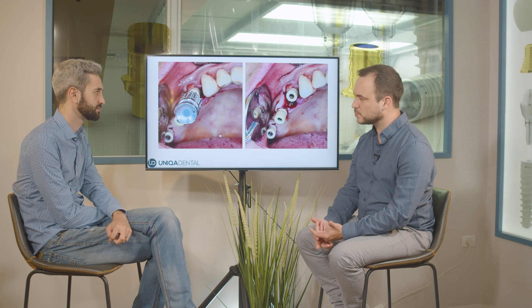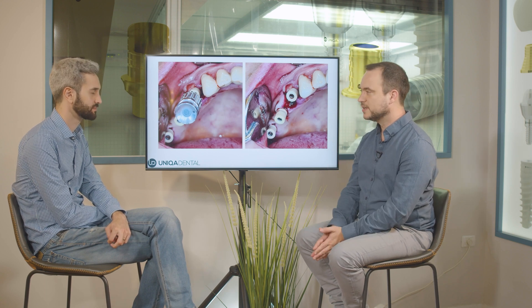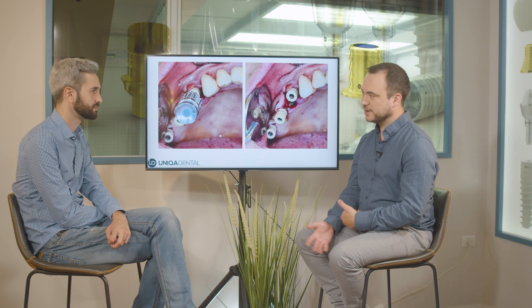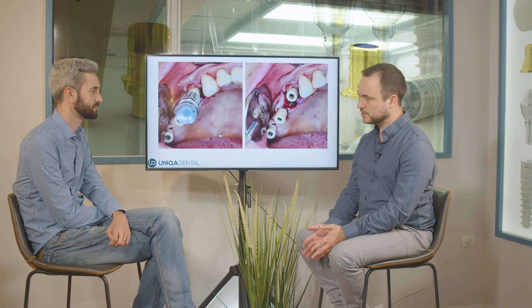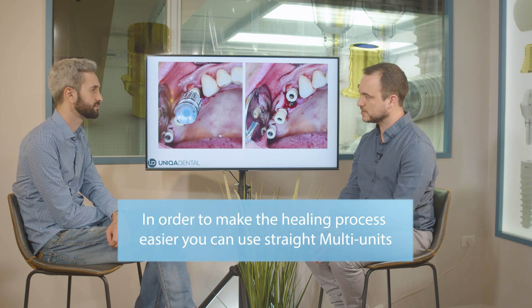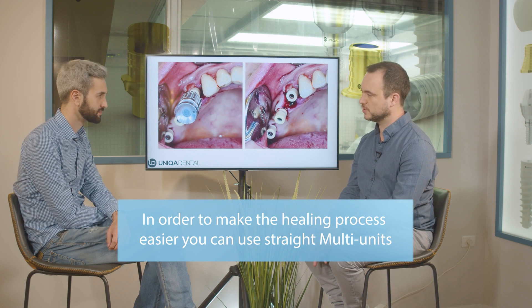We're putting straight multi-units for the gingiva to heal. The easiest approach is to put straight multi-units for the temporary bridge — you can mask the screw channel openings with composite material. You don't want, during the healing process with all the blood and inflammation, to start using angled multi-units. Put three straight multi-units and then change in the future to angular ones once you know the final gingival height.